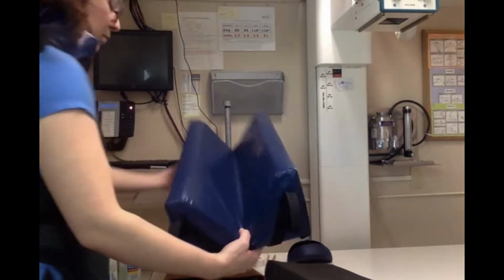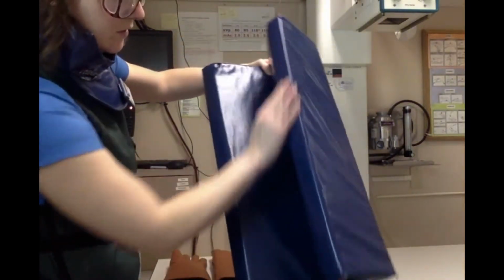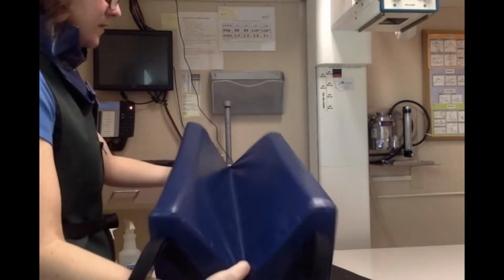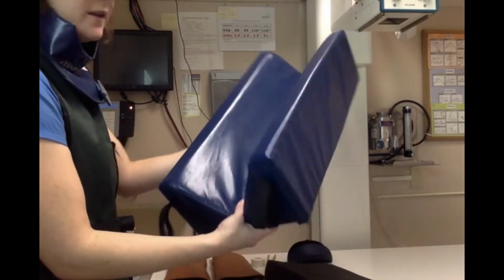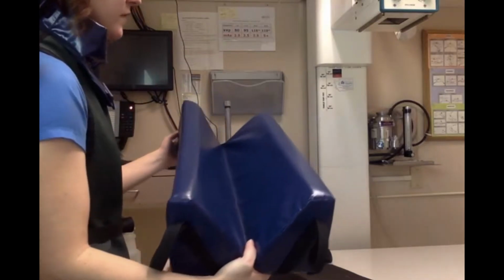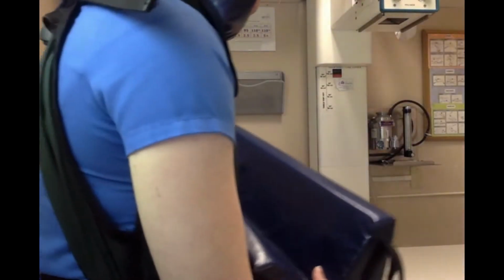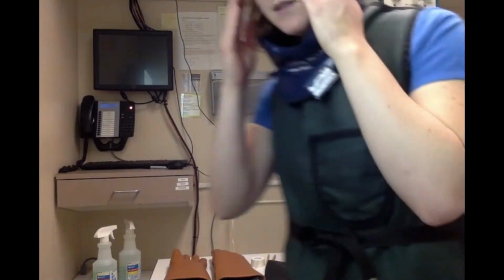So we have brand new foam troughs that, as you can see, they're nice and shiny. There's no cracks anywhere in the material. We have straps on the end if we want to strap a patient's leg in that way. So we make sure to keep the nice brand new foam troughs around. And then if this were to get cracked, we would either dispose of it or it would be our brand new trough for cystocentesis to hold patients there. But for radiation, we want to make sure that there's nothing in the way that would cause an artifact.